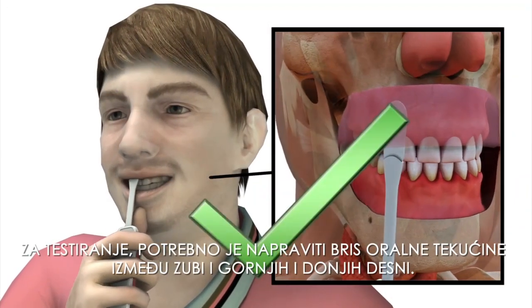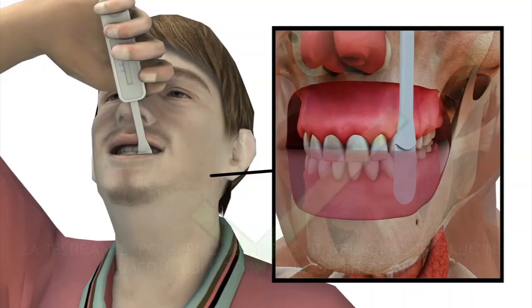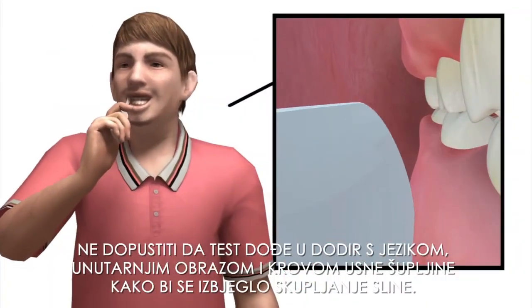To test, swab between the teeth and upper and lower gums for oral mucosal transudate. Do not allow the test kit to touch the tongue, inner cheek or roof of the mouth to avoid collecting saliva.